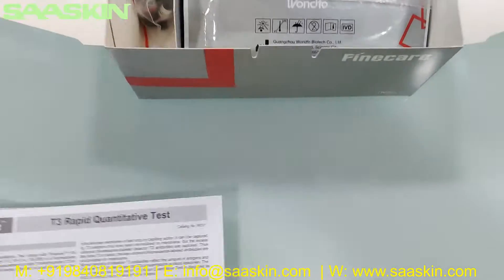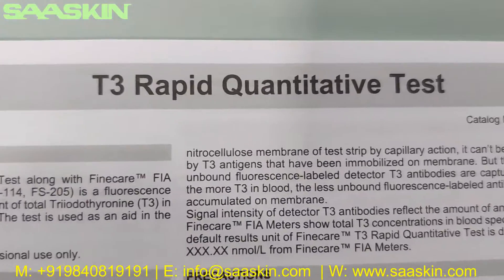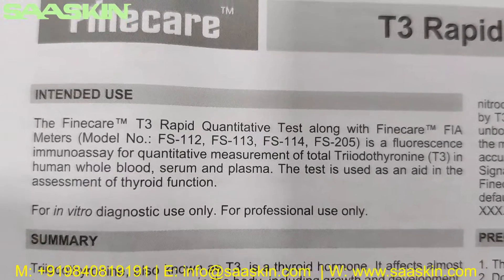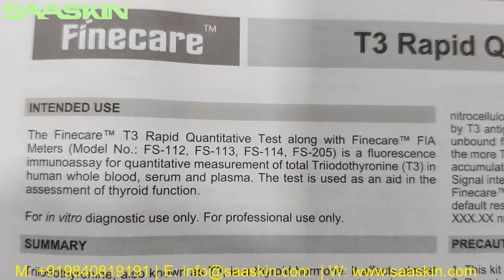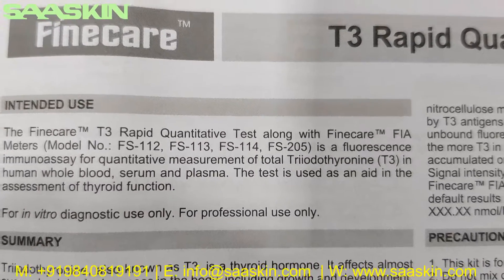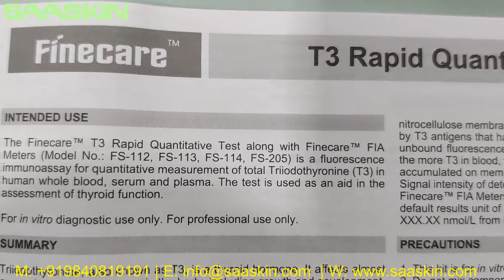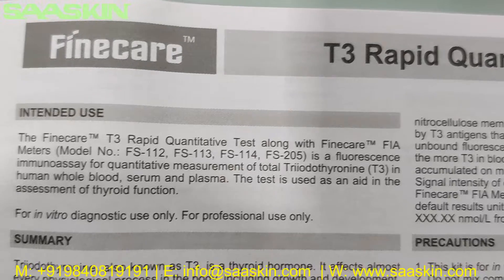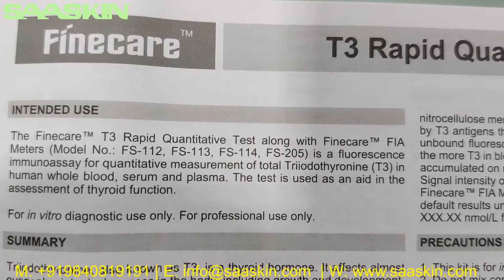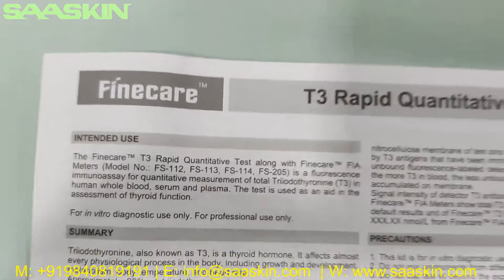Inside the box you can see there is one IFU brochure. It says FineCare T3 Rapid Quantitative Test. The FineCare T3 Rabbit Quantitative Test along with the FineCare meters is a fluorescence immunoassay for quantitative measurement of total triiodothyronine (T3) in human whole blood, serum, and plasma. The test is used as an aid in the assessment of thyroid function.